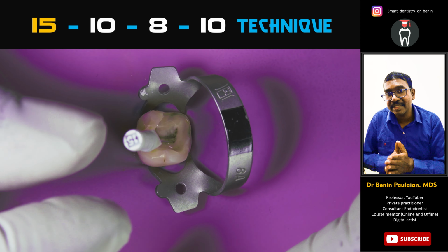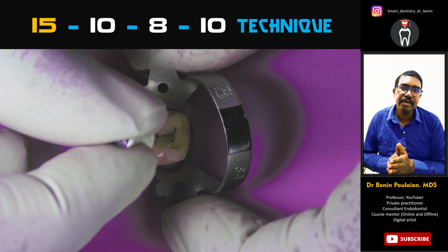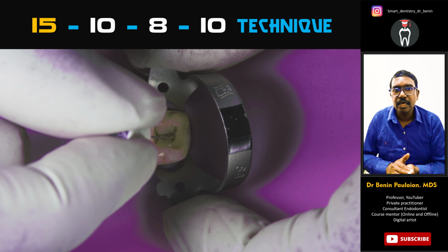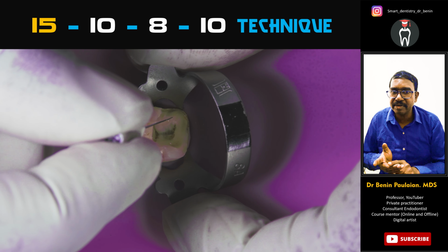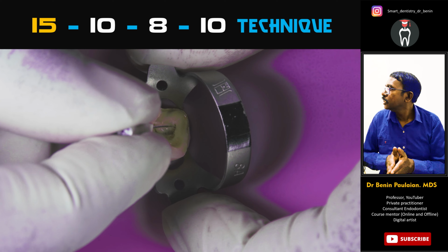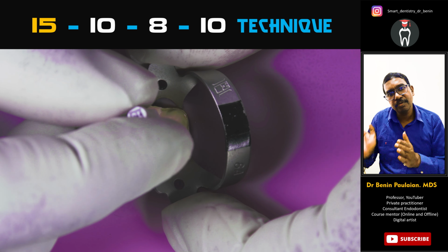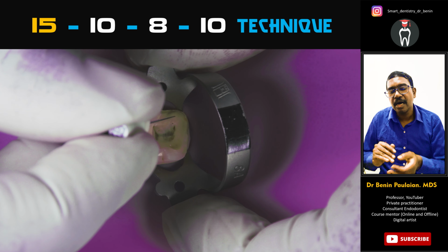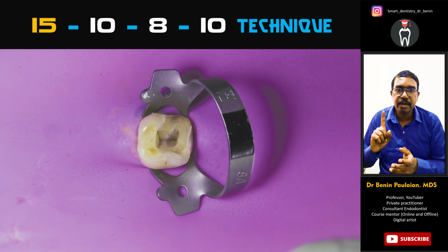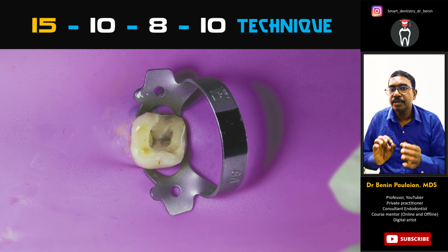So if you are using this motion, we will never create a ledge. At the same time, you will never create a blockage, and you will never fracture a file also. So one by one canal followed by the other canal, just enlarge or negotiate the coronal 1/3 only. Do not push.